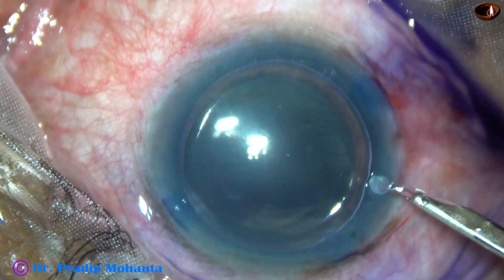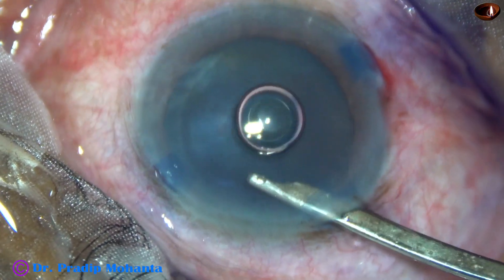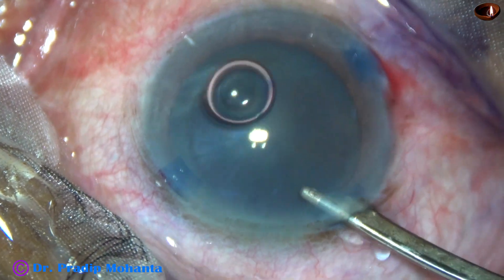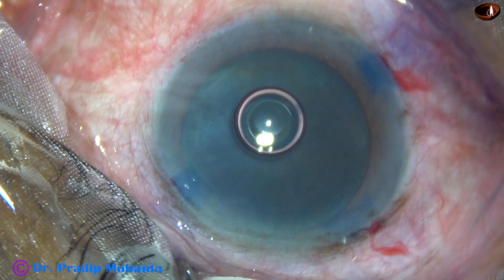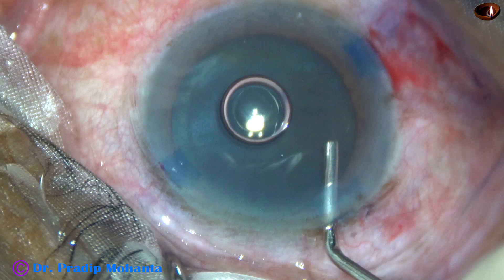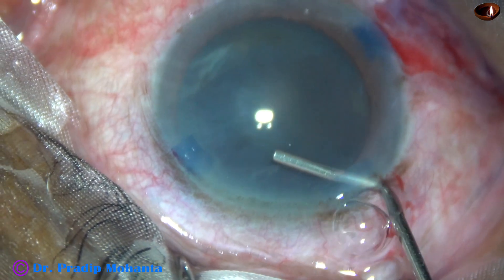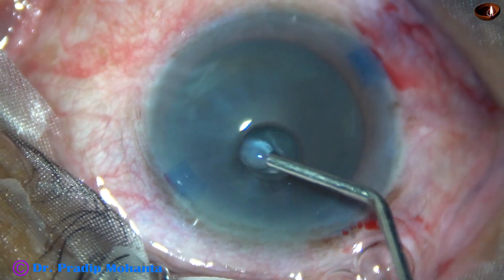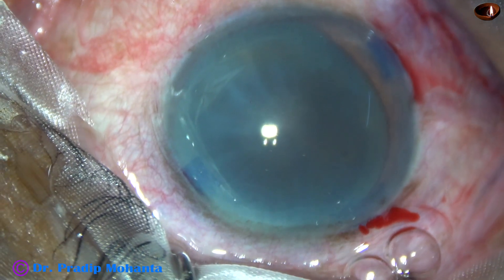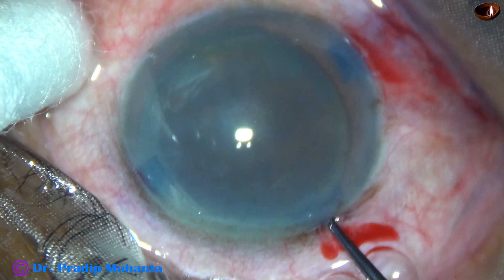By this time, all the incisions have been made and the capsule has been stained with trypan blue dye. Now, 2% hydroxypropylmethylcellulose is going to be used as the viscoelastic substance. This is 2% HPMC filling the anterior chamber, and it is applied over the cornea for better visibility and for epithelial protection.